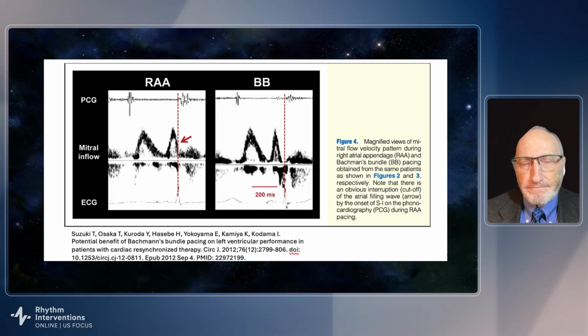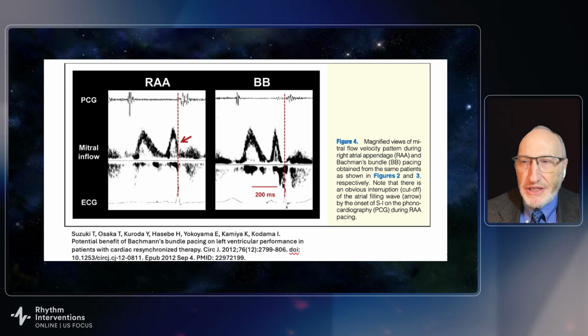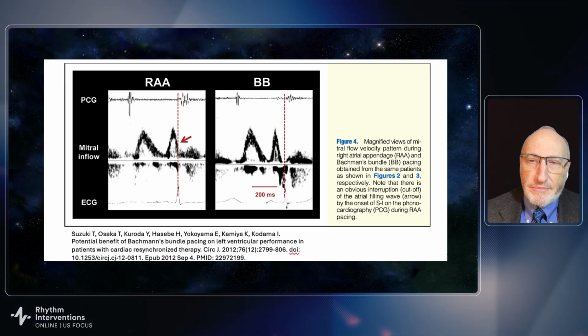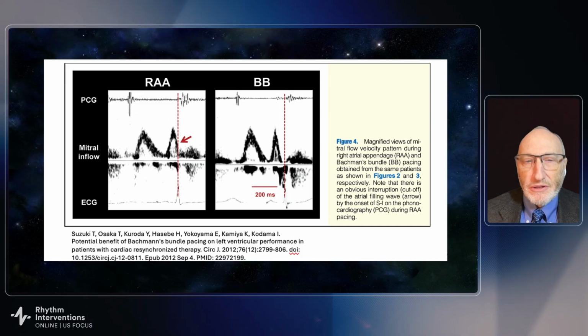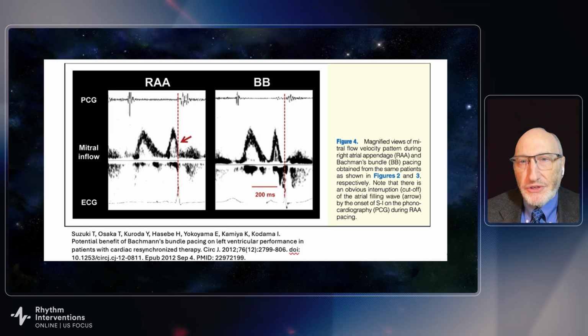One other advantage that was demonstrated somewhat later as CRT therapy came out was that by accelerating electrical activation to the left atrium, you could accelerate mechanical contraction, as you might expect. And therefore, when dealing with CRT patients, it was important, I think, to allow activation to occur.